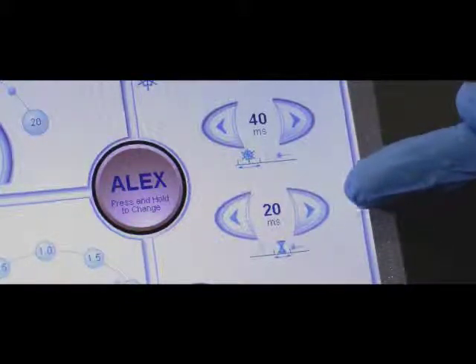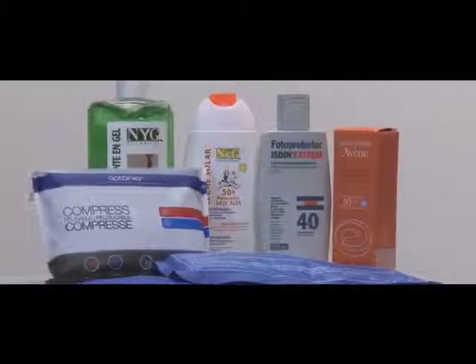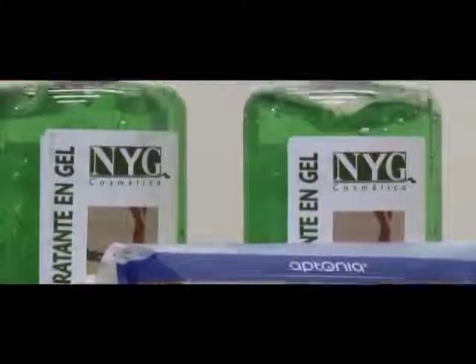After the treatment is complete, you may use cool packs if desired, especially in the case of excessive redness. Otherwise, hydrating the skin with aloe vera gel or topical hydrocortisone and instructing the patient regarding continued hydration and sun protection are important.